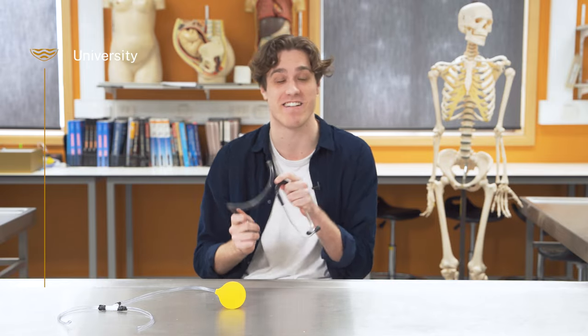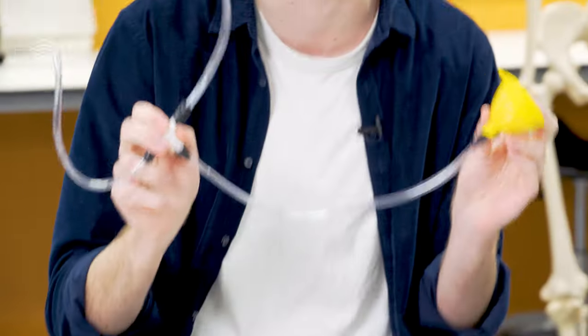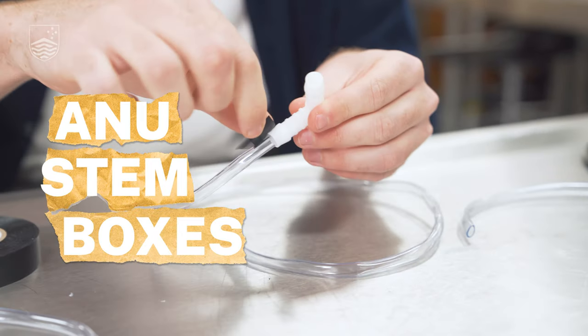So this is a stethoscope. You might see it around the necks of doctors, but I'm going to teach you how you can make one from stuff you might have around your house. Hello, my name is Henry and I am a second year medical student here at the ANU College of Health and Medicine.